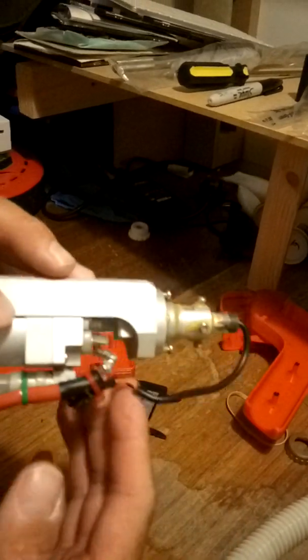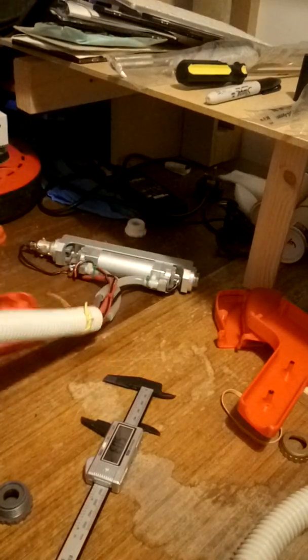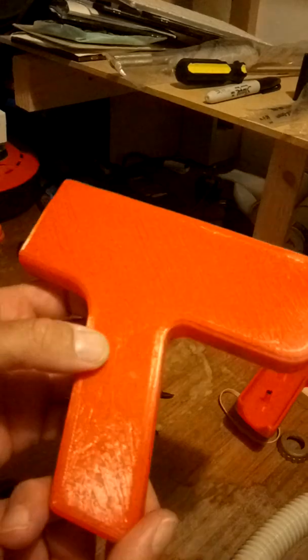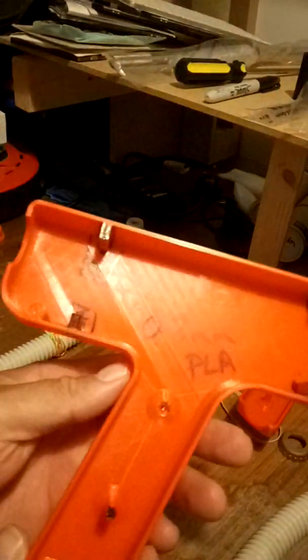So if you want to get in touch, let me know how you're getting on. I'd be grateful. So at the moment this is a 3D print. As you can see, the finish isn't what I'd say perfect for final production, but I mean, just for prototyping it is excellent. This is 2mm PLA.